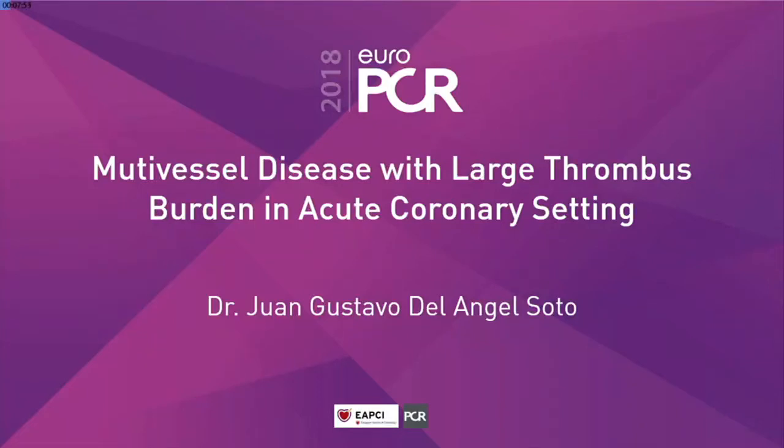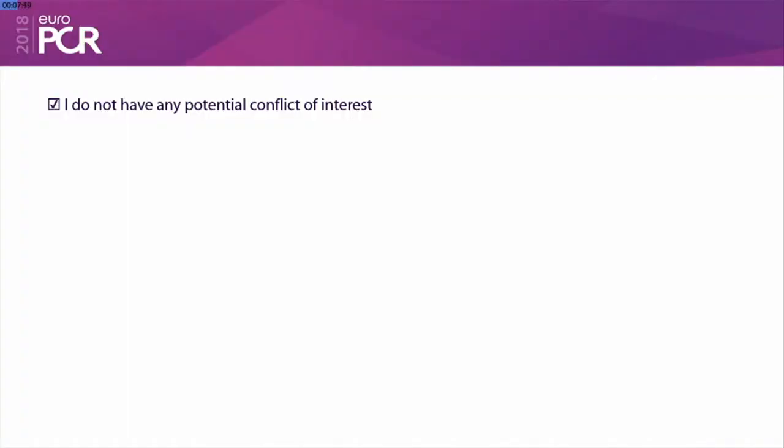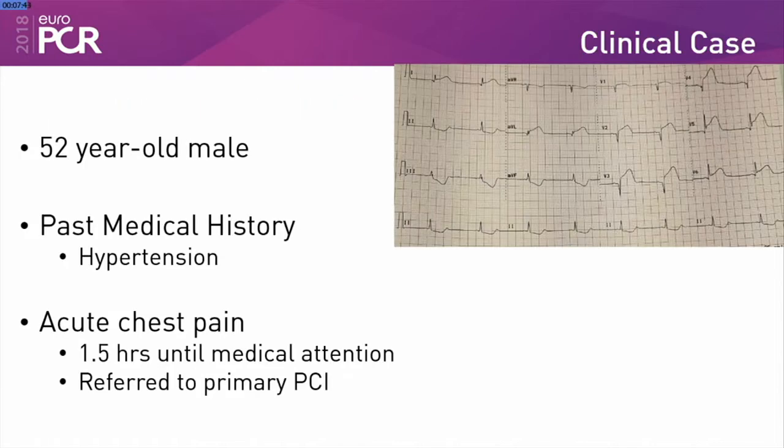Actually, I'm going to present a case that is not done at my institution. This is a different institution that does have as many. So it means that you can express many criticisms because the operator is not here, right. Because you're going to ask why I didn't do in the other case what you're going to see in this case. So let's start with this case.